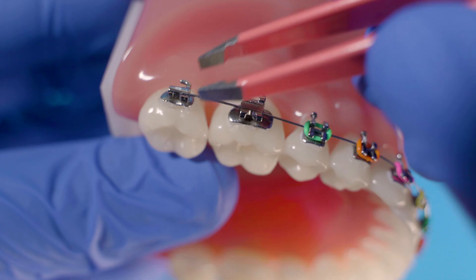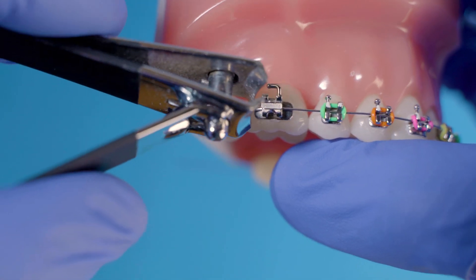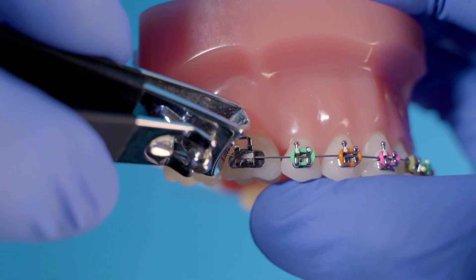There are a few things you can do at home to help too. If a wire has come out of the last bracket, you can try to put it back in the tube by directing it with tweezers. If the wire won't go back in and is poking you, you can ask a parent to help you cut the wire with a nail clipper at home and use some orthodontic wax for comfort. We'll fix it at your next appointment.